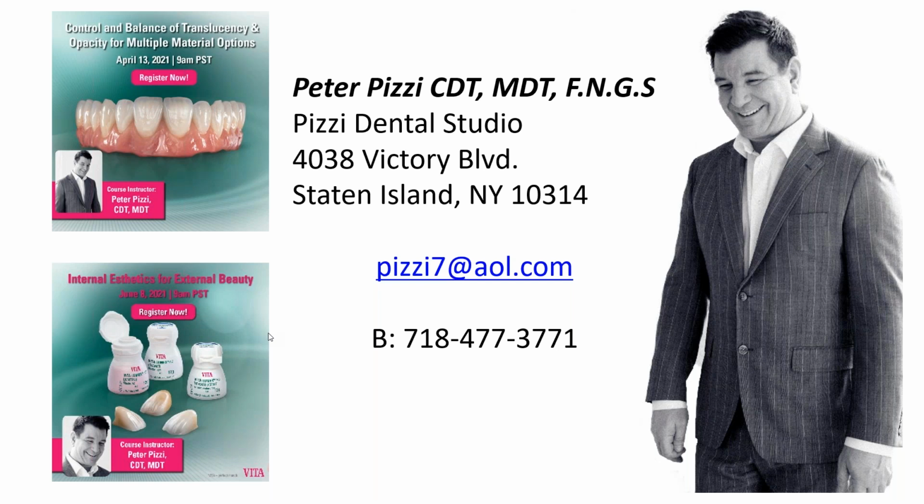How do I do that? By closing my f-stop. The more that f-stop is f32 or higher, the smaller the opening in, the less the area around me is a distraction. So I could take my camera, I could walk into a well-lit room and shoot that patient and get almost a perfect photograph. I could then take that patient into a closet, into an environment, completely dark space, and take the same photograph, and my photographs will look the same. I don't want the influence from the outside.